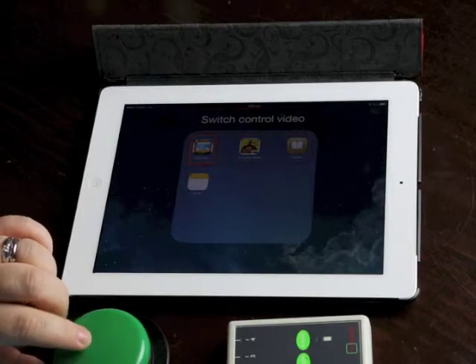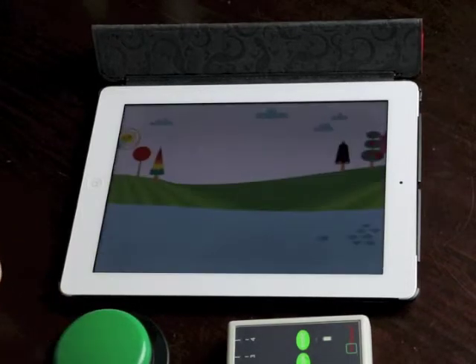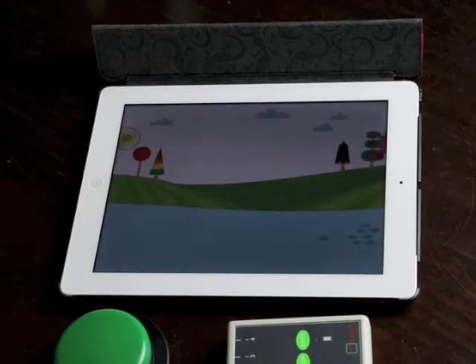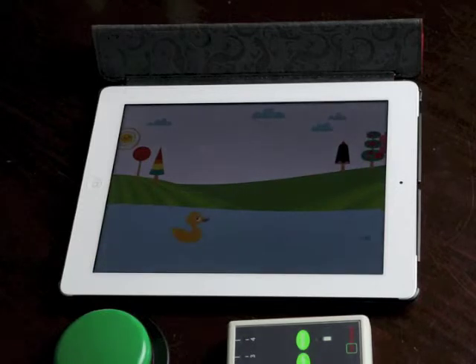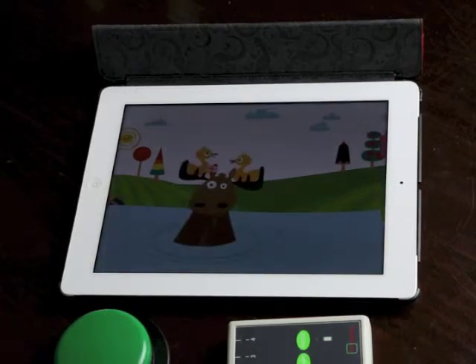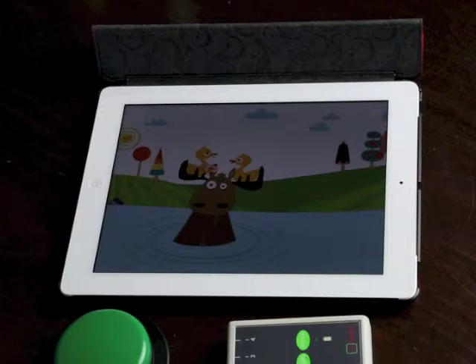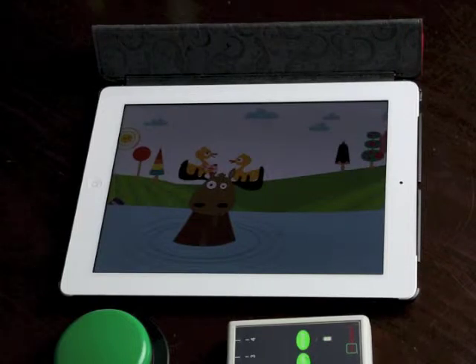Switch control video, bust, bus HD, tap. And let's go back into wheels on the bus. Switch control video, duck, duck, video, video, video, video. It completely crashes this app having the auditory scanning turned on.